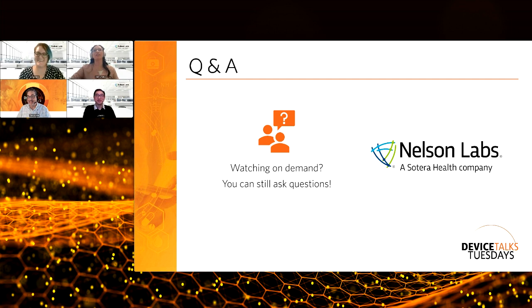Yeah, so this question here is really asking, how do we assess biocompatibility when we have a change in our manufacturing process? So we've started with a machined component, we're moving to injection molding. So there are differences in those processes, and we want to understand if there's different additives or contaminants that the product can be exposed to during that, possibly oil or grease from the different types of environments where the processing will happen. And so what you're going to hear Katie and Lucas and I talk about often, we'll say it in lots of different ways, but our favorite biocompatibility answer is it depends. So we want to ask some really good questions, and you'll hear us follow through that process every single time.